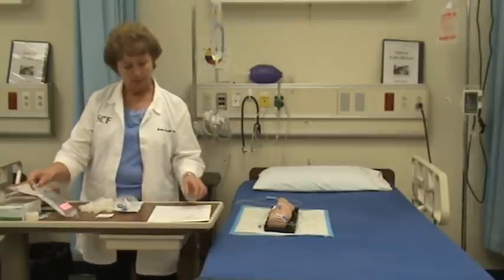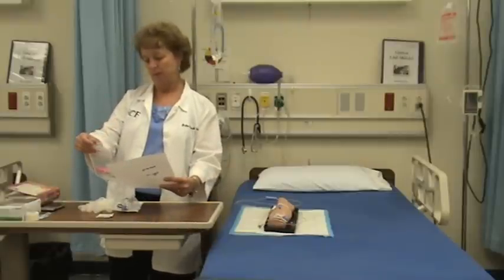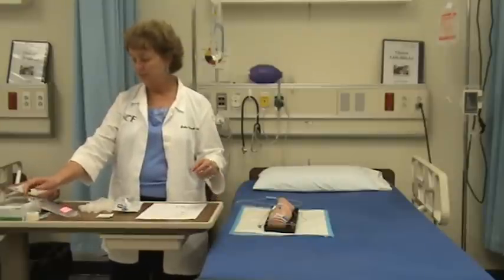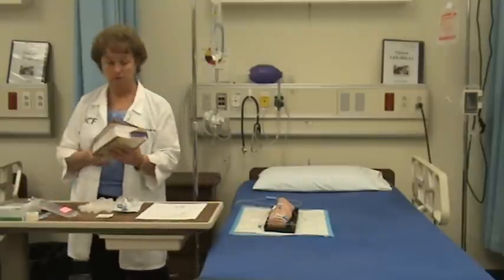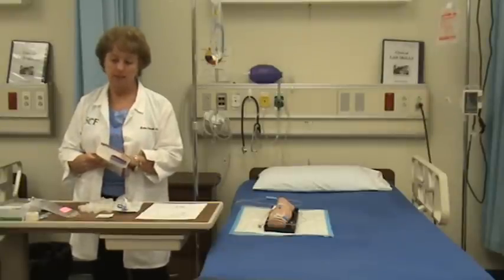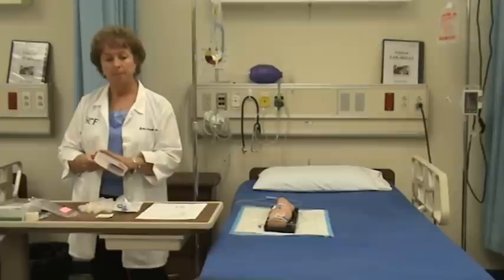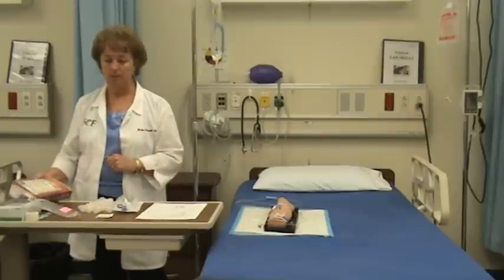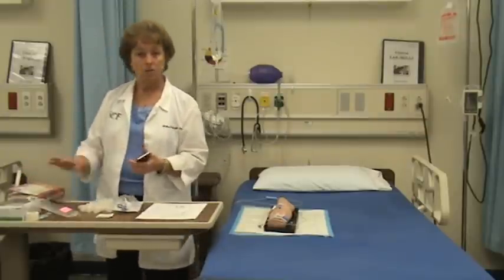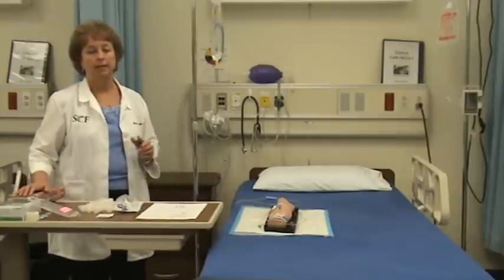I'm going to do one more check at the Pixis or medication room that I have the correct drug, which is ampicillin 500 milligrams. I've also looked up the drug in the drug reference book and found that ampicillin can be given over 20 to 30 minutes. To make my calculation easier I'm going to give it over 30 minutes, and I've checked that it's compatible with the running IV — and it is compatible.